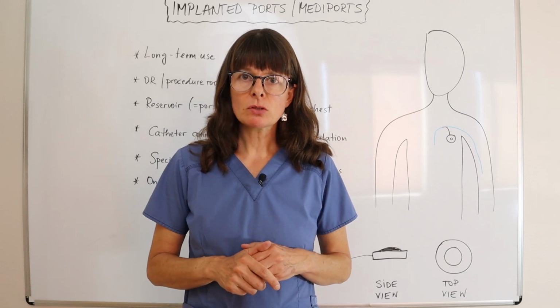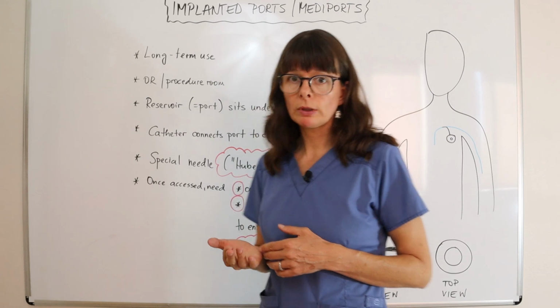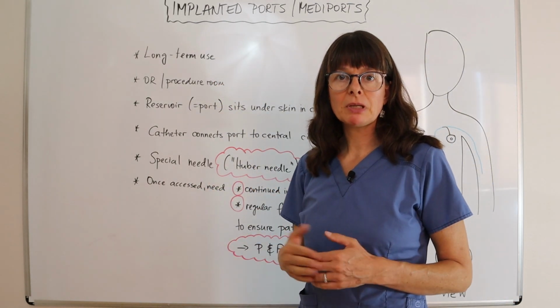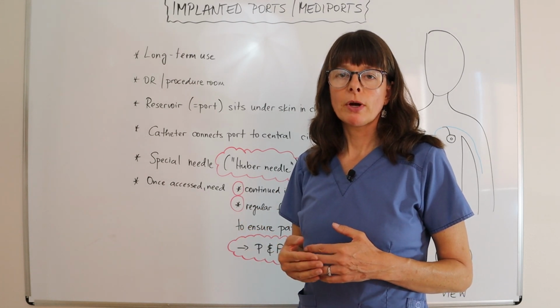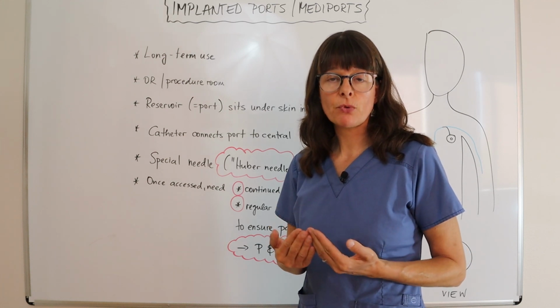This video is on implanted ports, or Mediports, which are part of the central line family. Mediports or implanted ports are used for long-term therapy only. They are usually used for patients that require chemotherapy at regular intervals, where we don't want to have anything exiting the skin and put them at risk for infection.